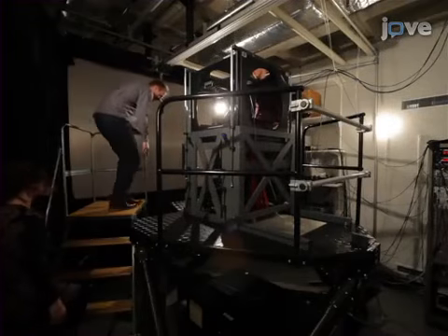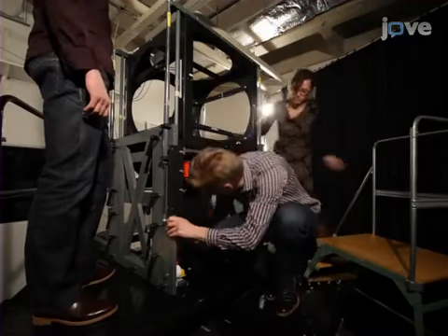To begin this procedure, seat the subject on a chair mounted at the center of a motion platform.